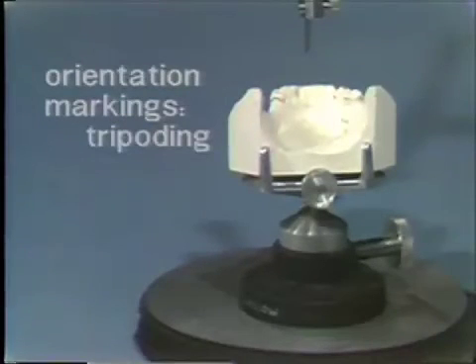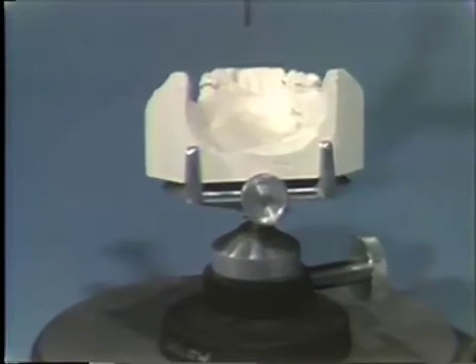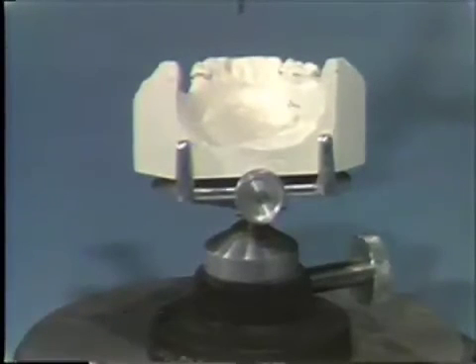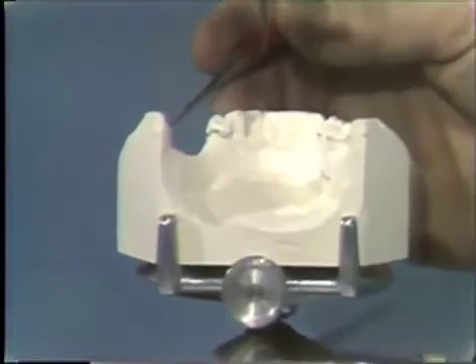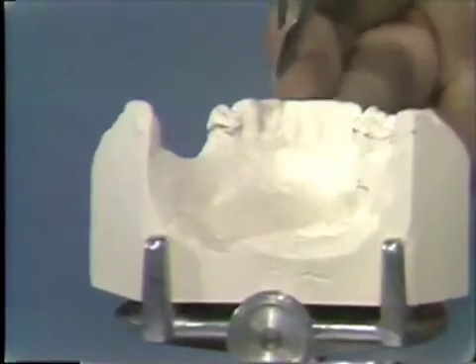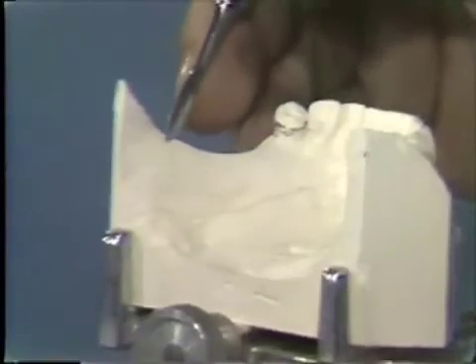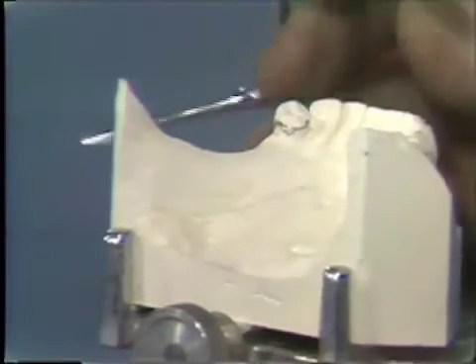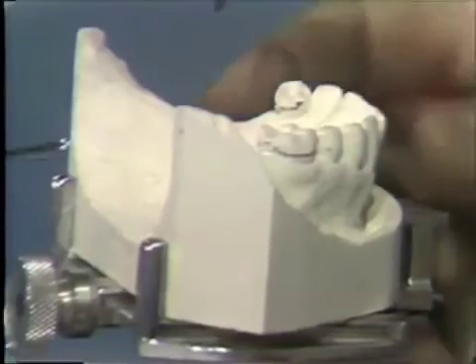Tripodding is a method of marking the diagnostic cast while it is on the surveyor cast holder at the chosen tilt or path of insertion and removal, so that this cast or any new casts made from subsequent impressions of the arch can be repositioned on the cast holder at the same tilt. We look for three widely spaced spots on areas of the cast which will be reproduced in any impression you make of the arch. Try to locate these spots on rugae, on teeth, or on folds of tissue for ease of location on the new cast. Do not use the base, the tongue space, or the buccal space, as these will not be duplicated in any new cast.